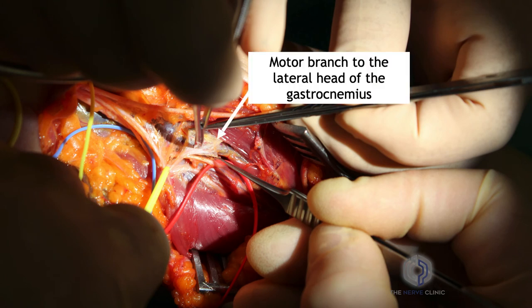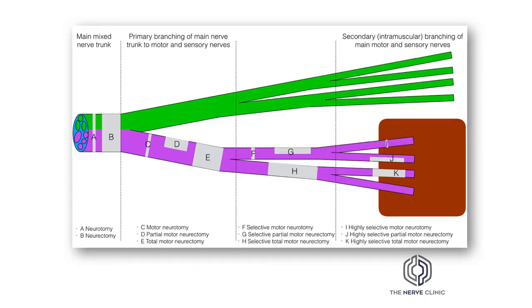This demonstrates the lateral head of the gastrocnemius muscle in the yellow loop, with individual branches being traced towards the muscle. The terminology for this type of surgery is called highly selective motor neurectomy, which is when a branch of the motor innervation to the muscle is removed close to or within the muscle. A highly selective partial motor neurectomy is when part of that fascicle is excised. A selective motor neurectomy involves taking one of the main branches after division from the motor branch, while a motor neurectomy is sectioning the whole of the motor branch to that muscle.